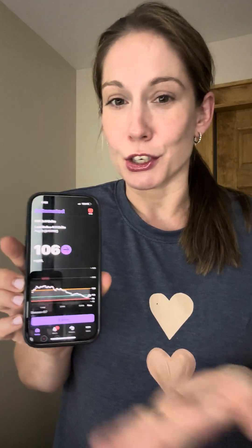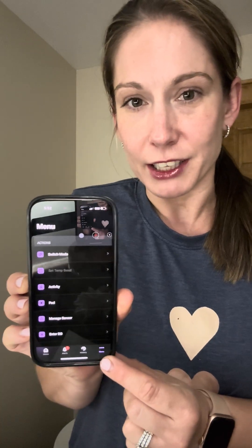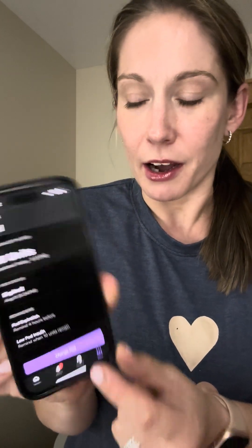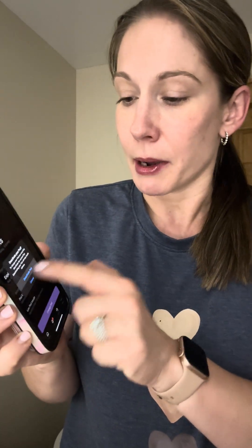To start, I went into my Omnipod app. This is the newer iPhone app where I can control it through my iPhone, which has been absolutely fantastic. So I'm going to go into Menu, then go into Pod, and right at the bottom you're going to see in purple it says 'Change Pod.' I'm going to click that — it's asking if I want to deactivate my pod, and the answer 100% of the time is yes. So: deactivate pod.